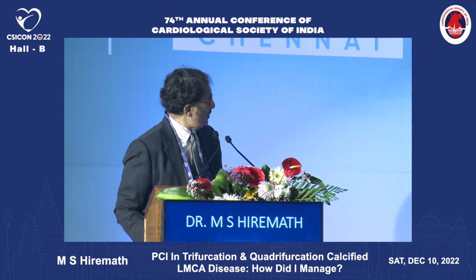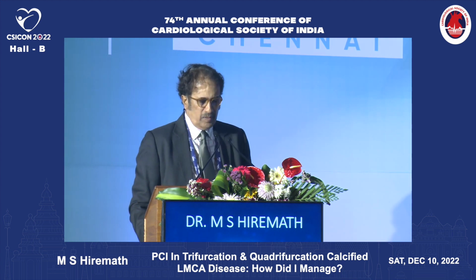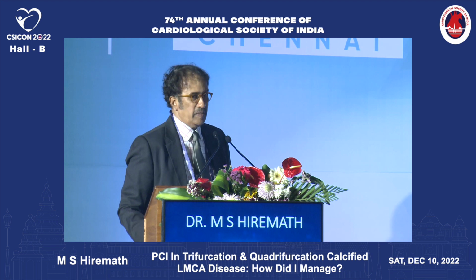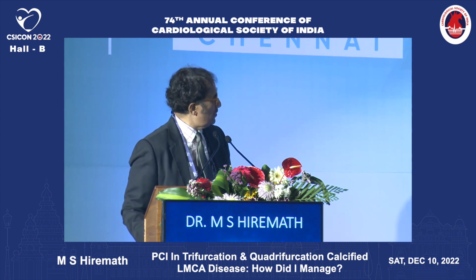So the first stent went from left main to LAD, do a POT, and then you bring in another stent towards the ramus, and you can see here it has a T and protrusion with the left main LAD stent, and you get this kind of result.